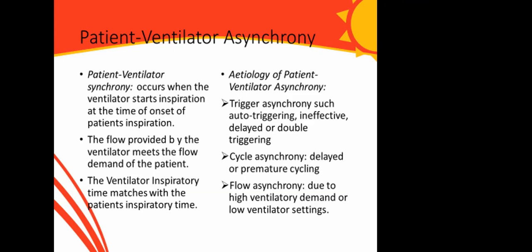It occurs when the ventilator starts inspiration at a time that doesn't match the patient's inspiration. So there's asynchrony; they're not working in tandem. Sorry, this is ventilator synchrony: they are working in tandem.